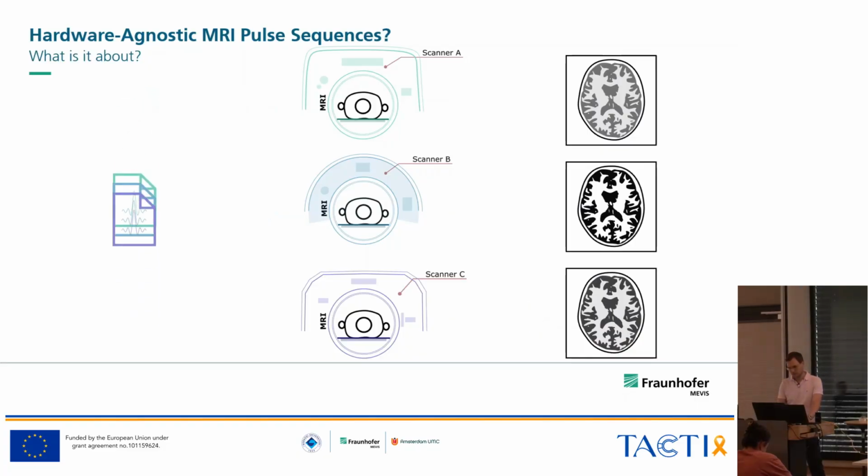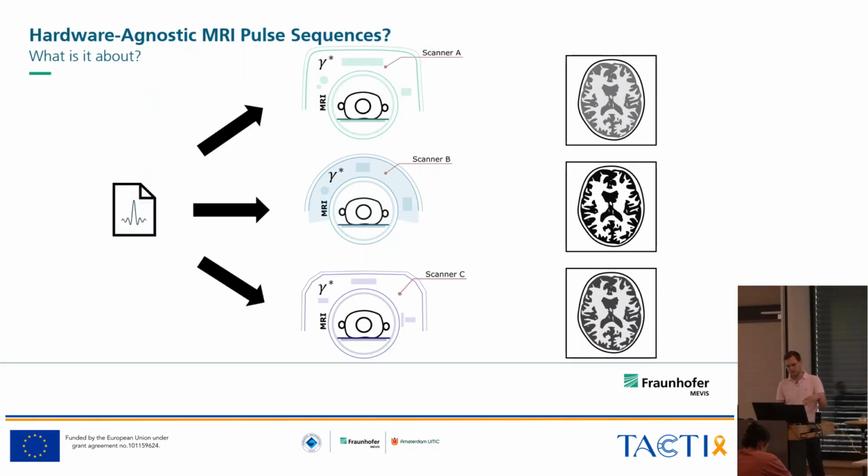So what we had in mind is to create a unified standard for MR sequences, a description language that is generalized, so that all the MR physics is saved in this one generalized file and then brought to the MR systems, and they hold a very, very lightweight software driver that then translates this general MR sequence into the hardware-specific control commands.